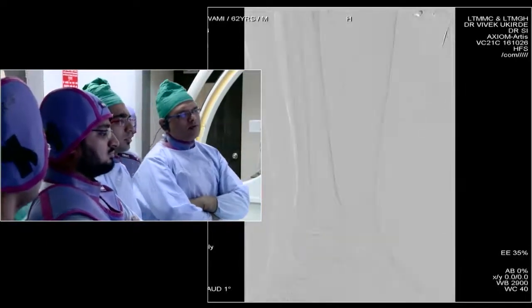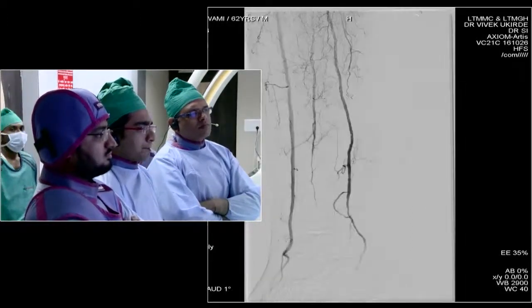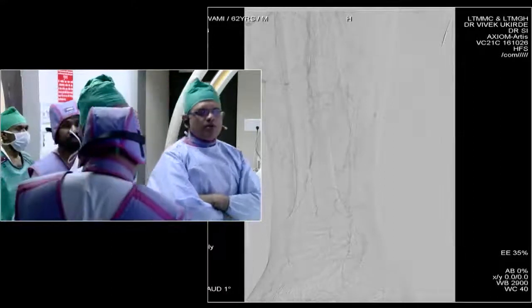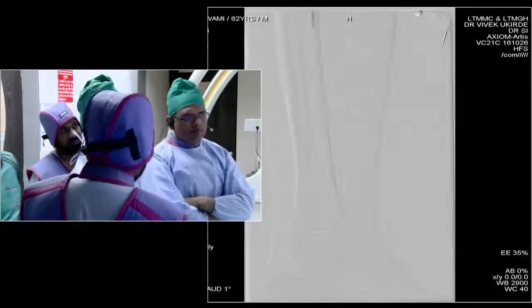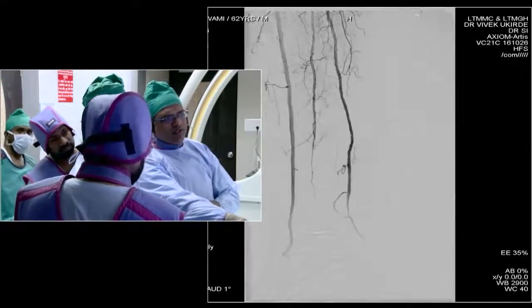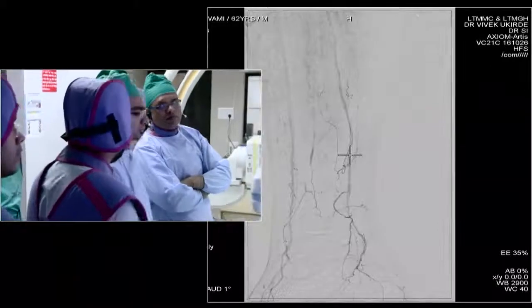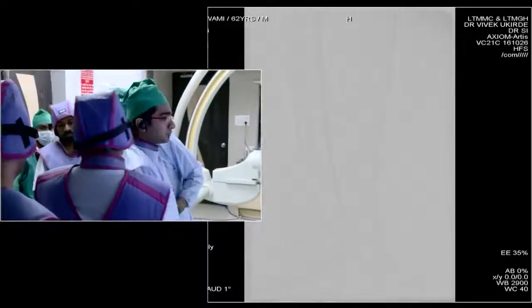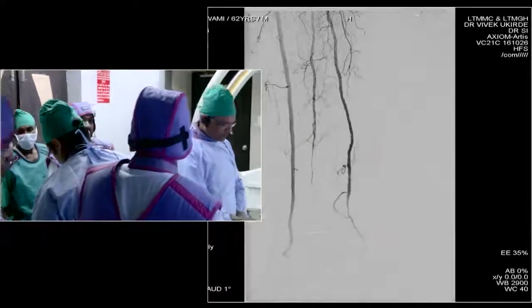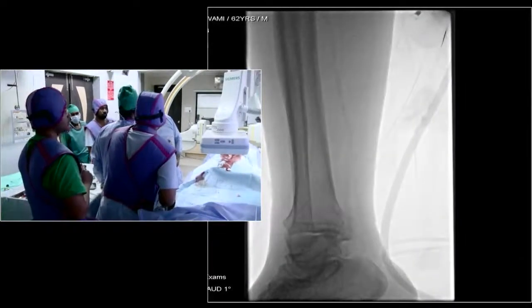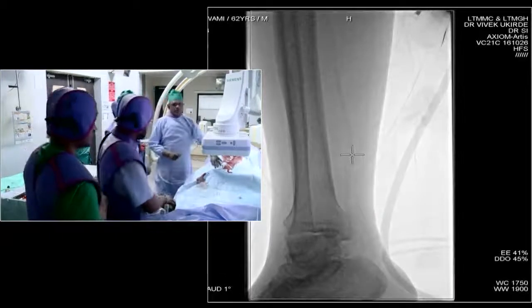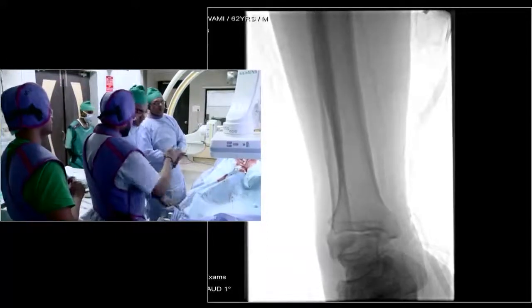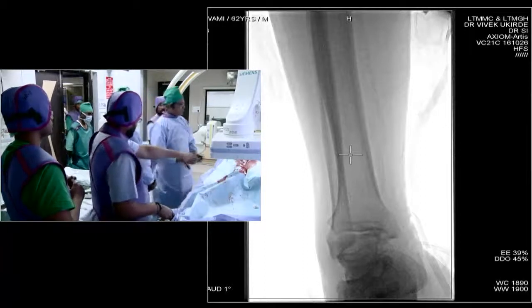Where are the ulcers in the foot? He has undergone amputation of the lateral four digits — the second to fifth digits are amputated. Let's focus on the left foot for a separate view. We have to realize that our target organ is the foot, so we should have good imaging of the foot before and after the angioplasty — that gives us a complete answer on whether this patient will do well or not.